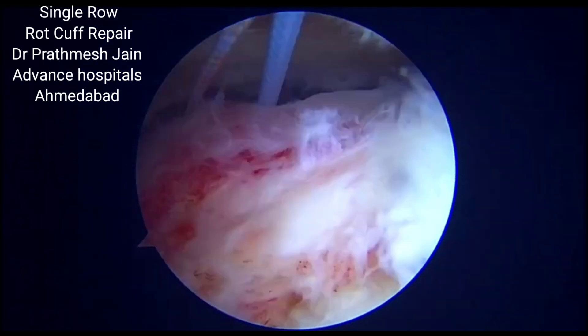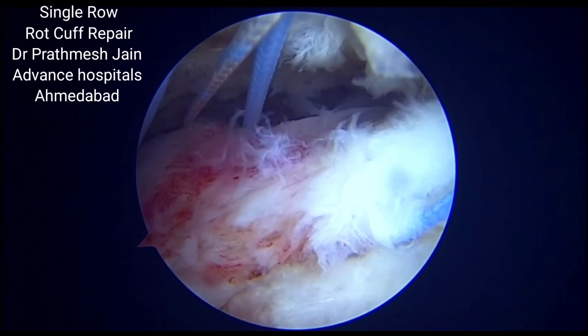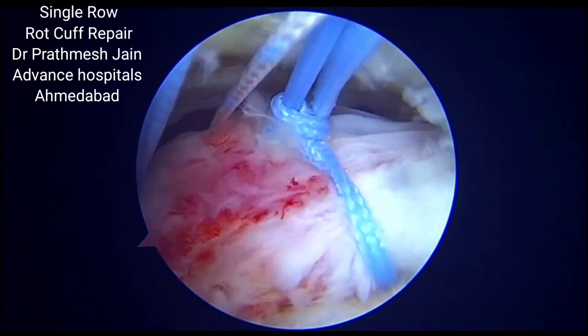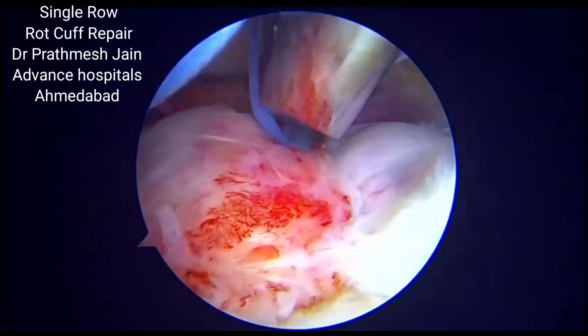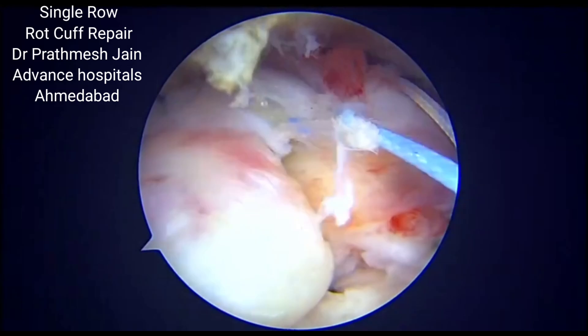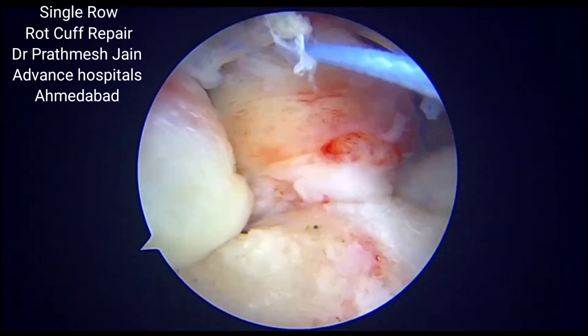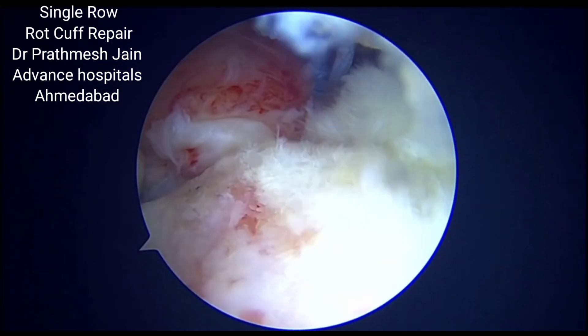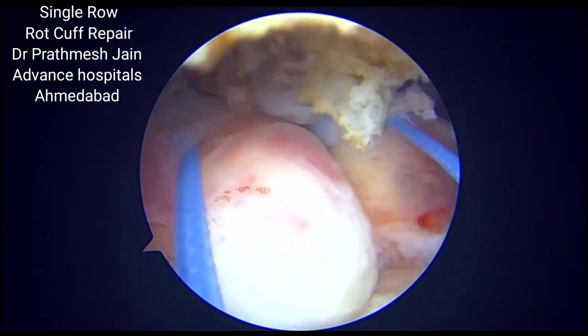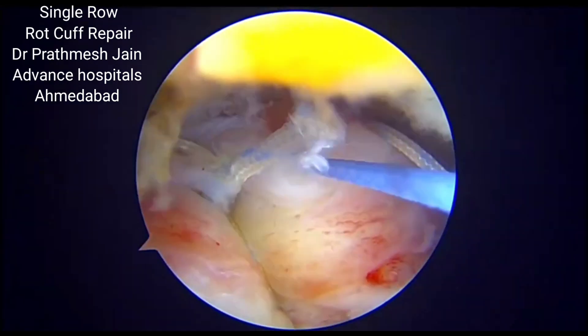Ideally, we pass and tie both the simple sutures first so as to reduce the rotator cuff tear onto its place. Once the simple suture is tied, we will be tying the mattress suture first on the posterior aspect and then on the anterior aspect.